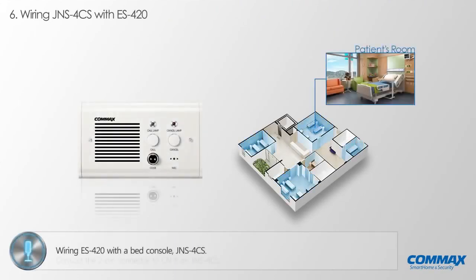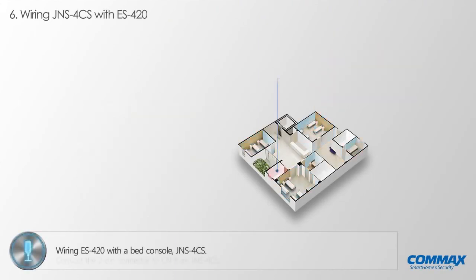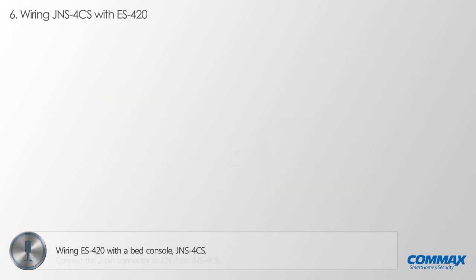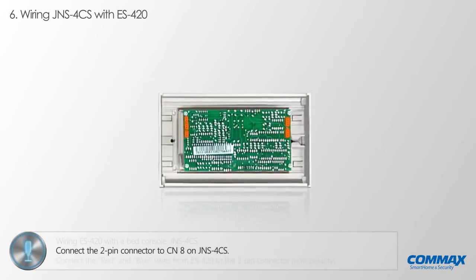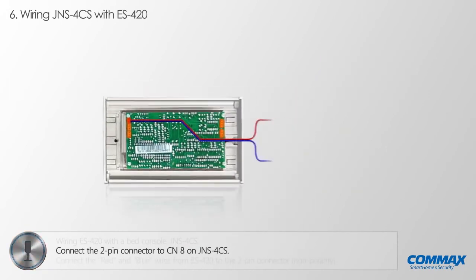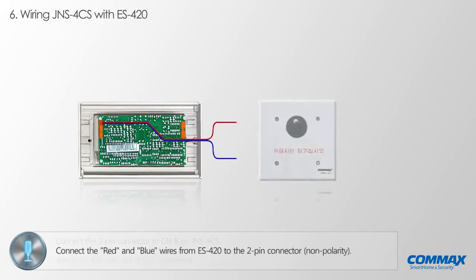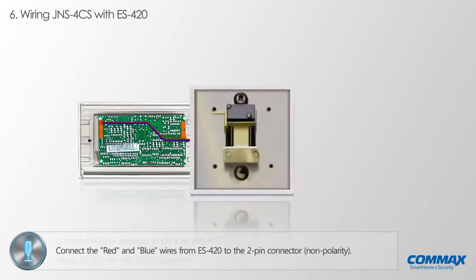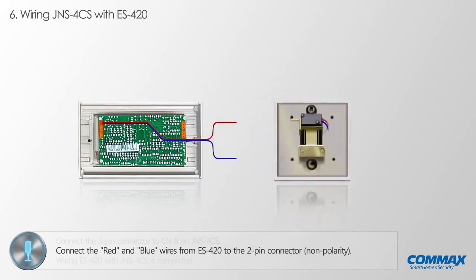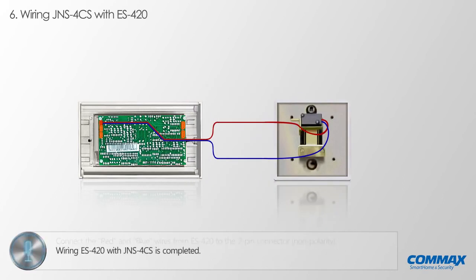Now we would like to show you how to connect ES420 to a bed console JNS 4CS. First, please connect the 2-pin connector to CN8 located on JNS 4CS. Please connect the red and blue wires from ES420 simply to the 2-pin connector from CN8 on JNS 4CS. Wiring ES420 with a bed console JNS 4CS is completed as shown in the above.